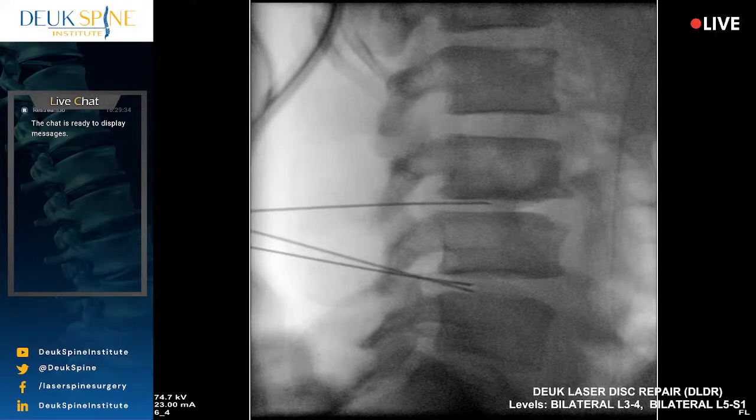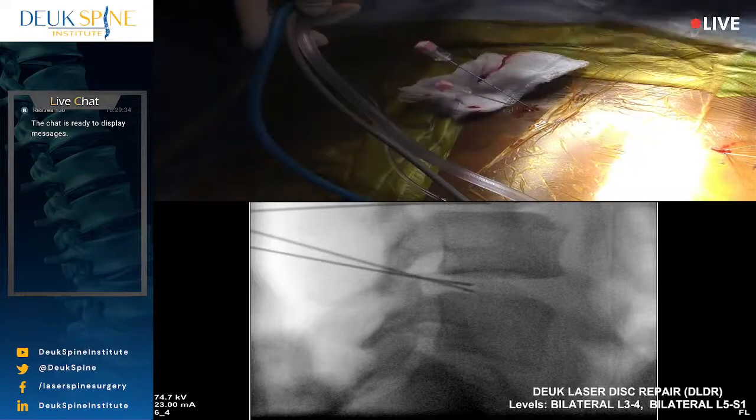All right, we're almost done. Then we'll put you to sleep, okay? So, second incision is here on the patient's right flank. So far we've lost maybe 10 drops of blood. So half of a milliliter. You're almost done. Just lay still.